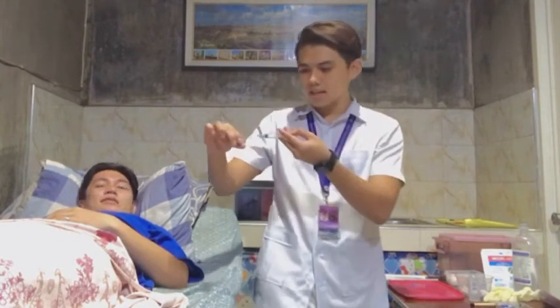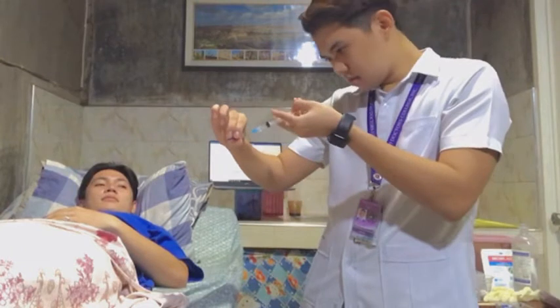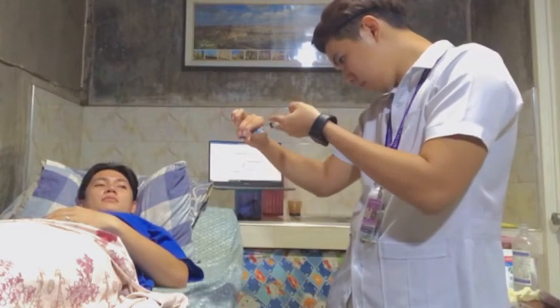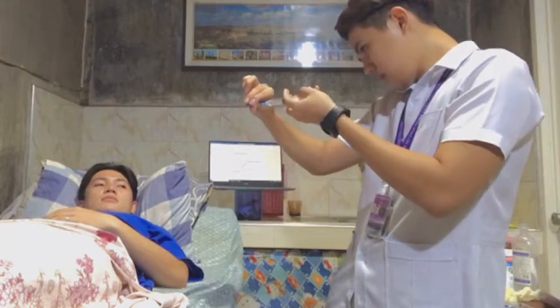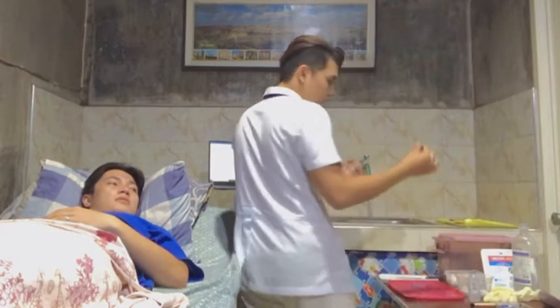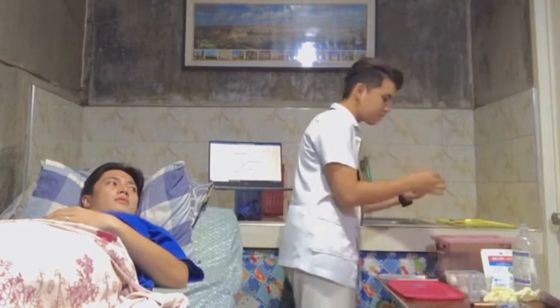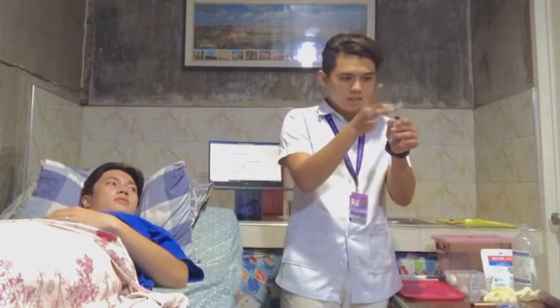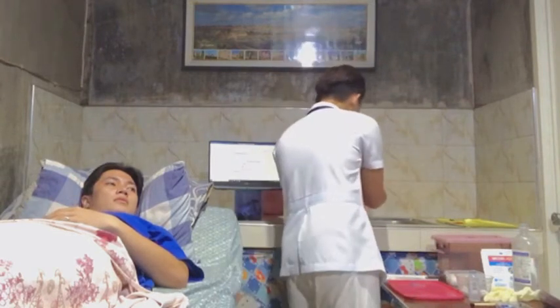So just like this, withdraw the medication, 3 ml. Okay. So of course, do not forget to throw this in the waste receptacle. So of course, flick this one and then avoid the excess.